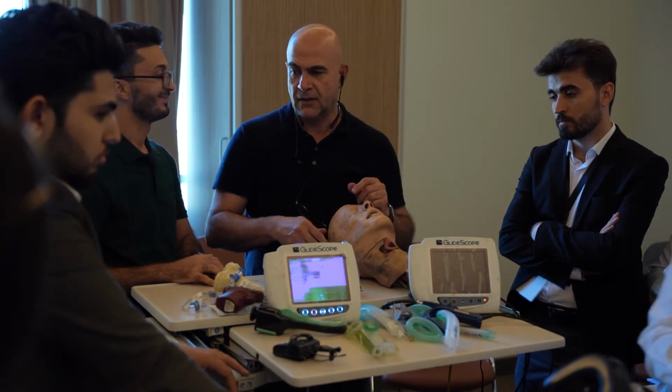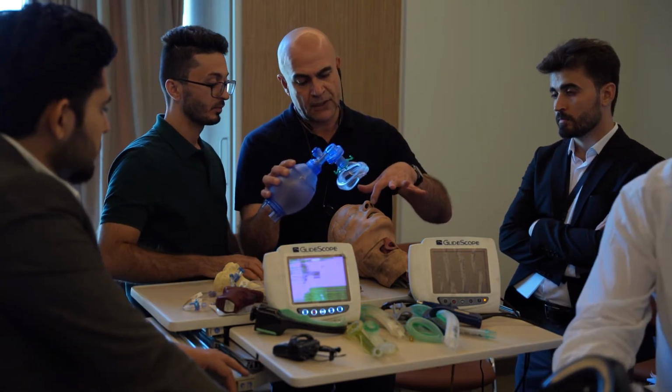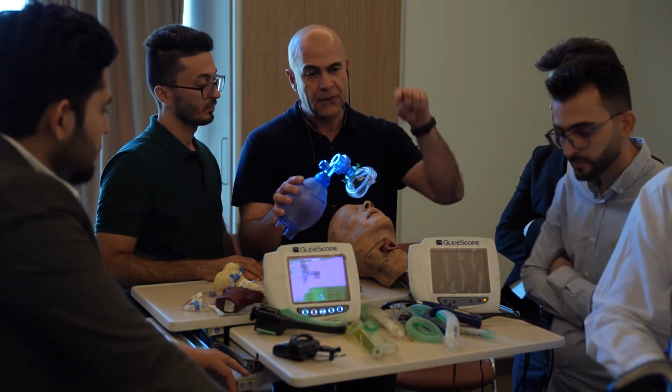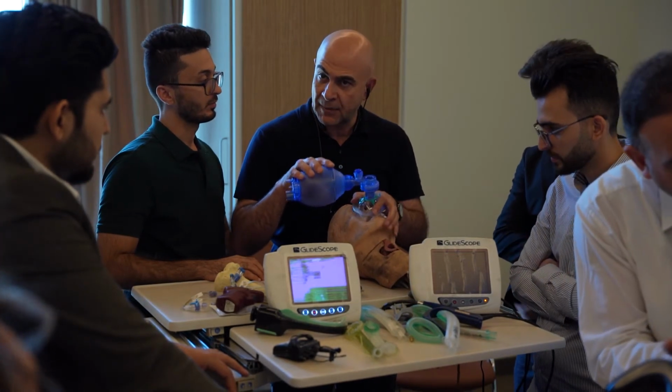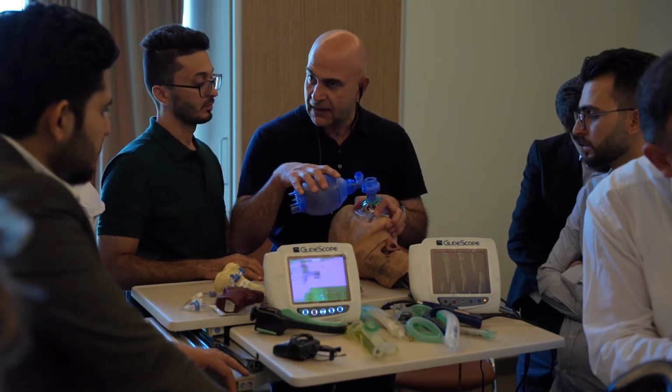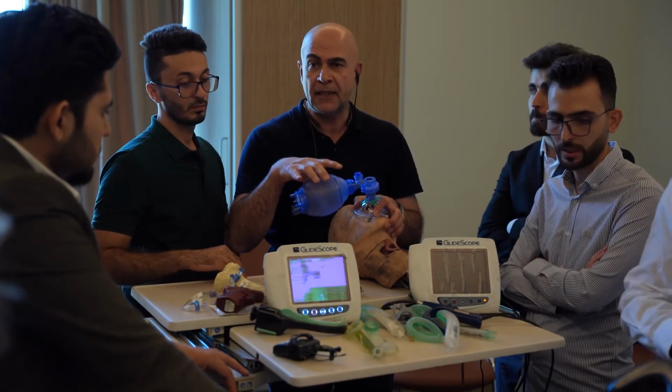I like it. Now you are going to open, clean, maintain, and ventilate. Open, clean, maintain, and ventilate. You should verbalize to me: open, clean, maintain, and ventilate.